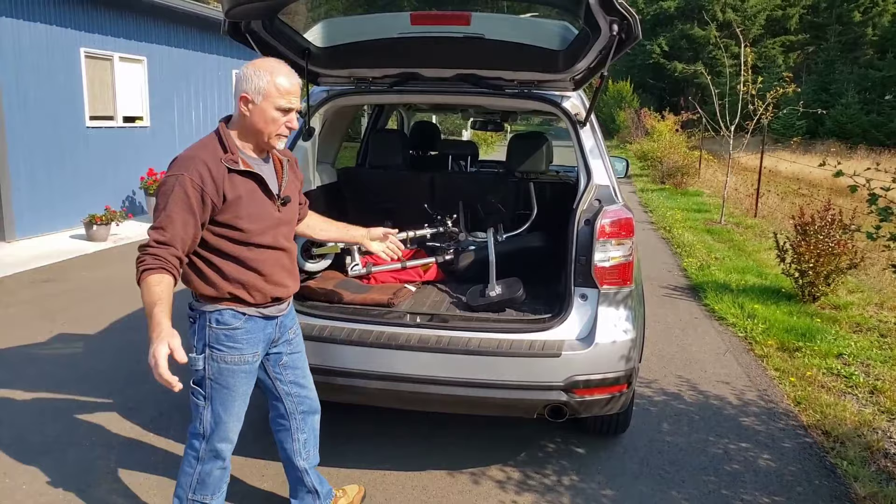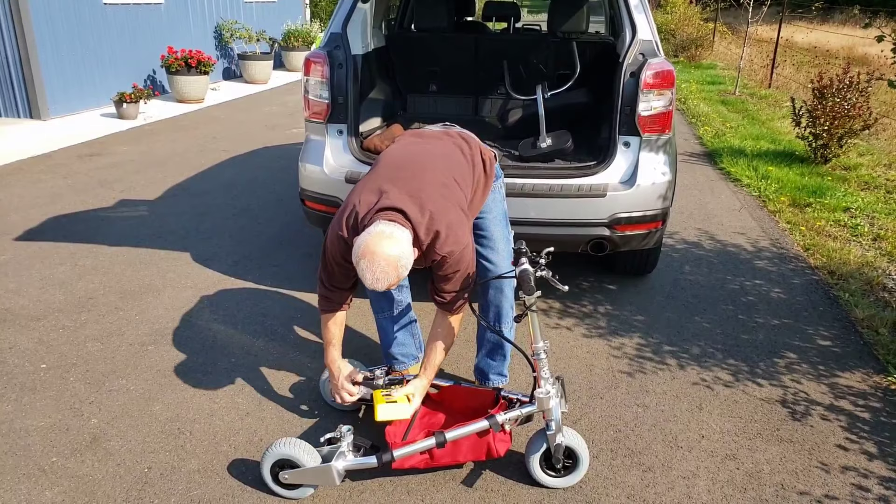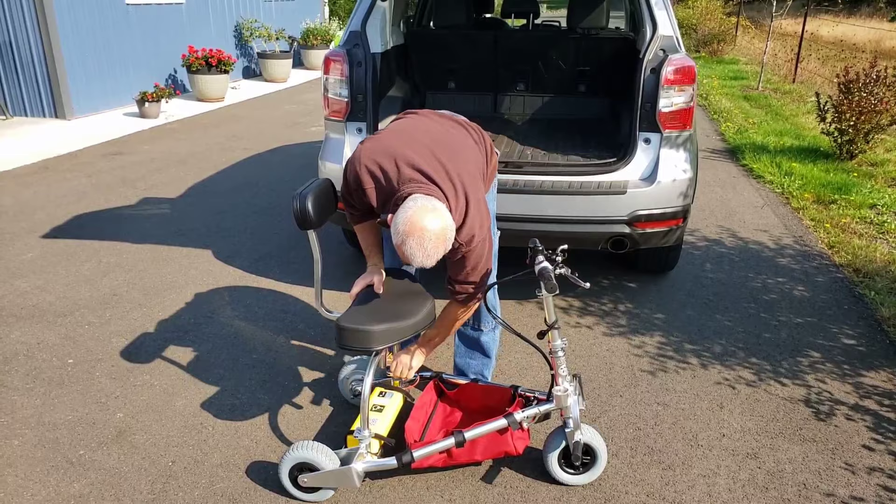To unload: take it out, place the battery bracket back in the brackets, take your seat, and you're ready to go.